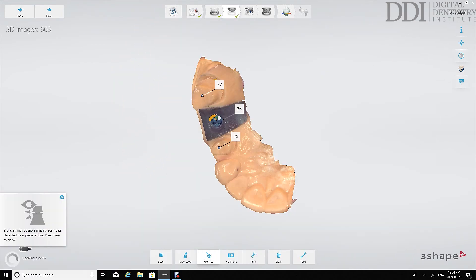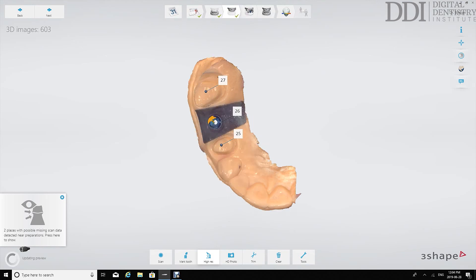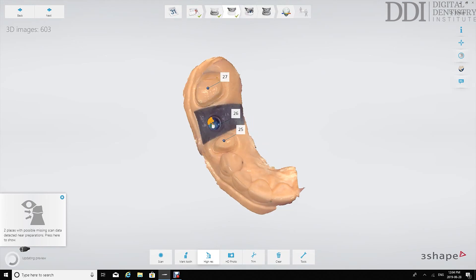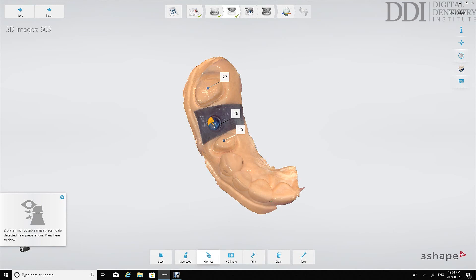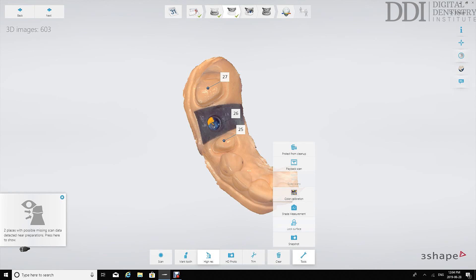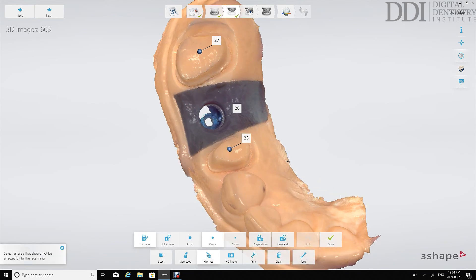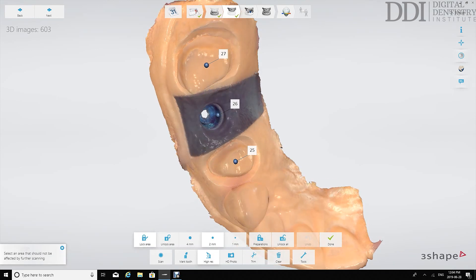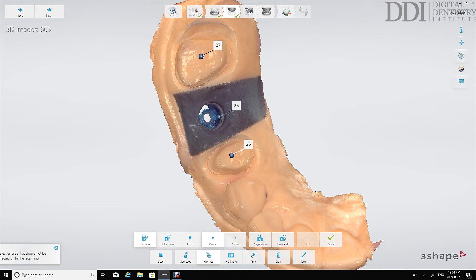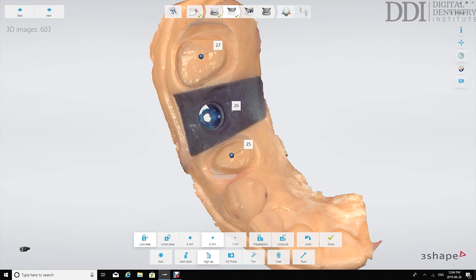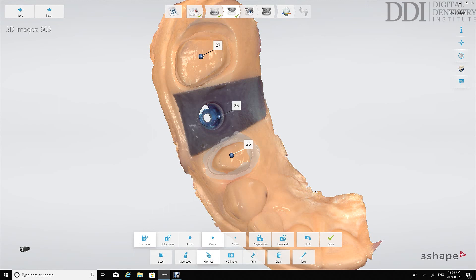Now that we've captured the margins in a more high resolution scan we're also able to use the lock surface tool which is found in this tool tab under lock surface. What that allows us to do is zoom into the areas where we've retracted the soft tissue and captured the margins and lock those surfaces so that throughout the rest of our scan if that tissue starts to collapse this part of the scan is unaltered and the margins will still be very clear.